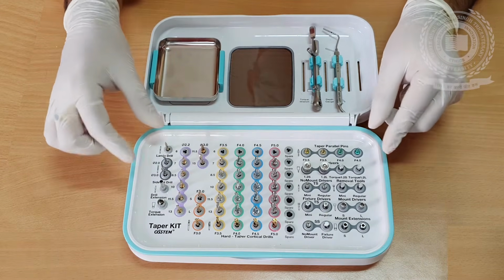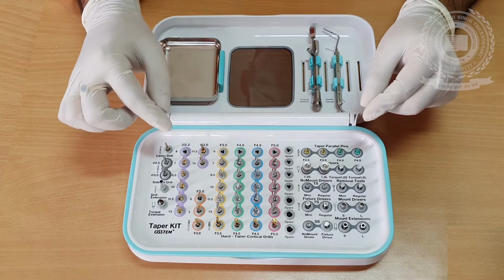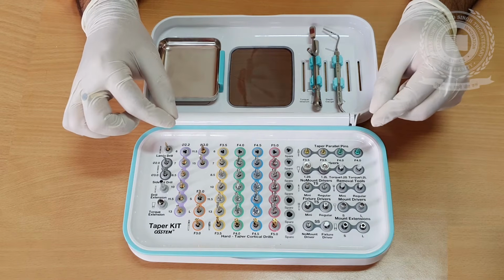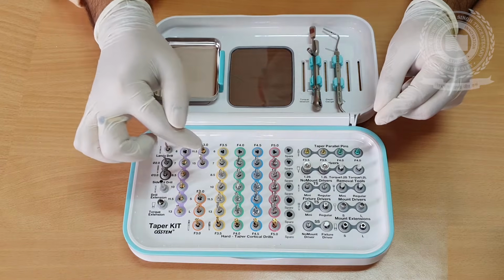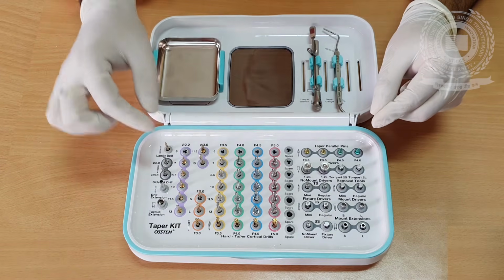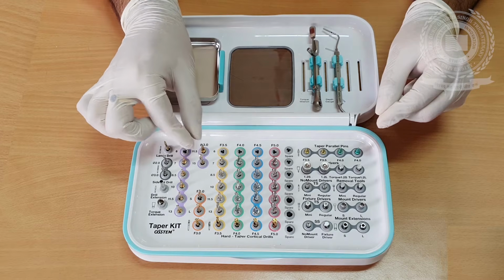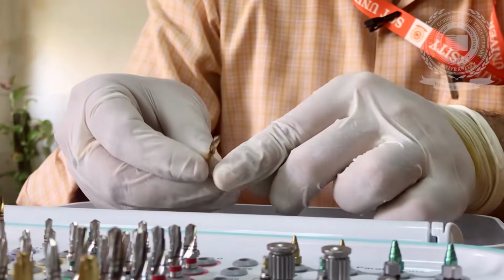So, before placing an implant, in a treatment plan phase, we have to determine that which diameter and which length we want to place in our patient. Accordingly, we start our surgery using different sizes and different diameter of drills. So after placing this drill, we can increase the size with the next number, that is 3.